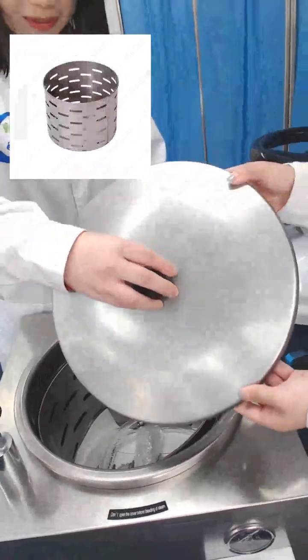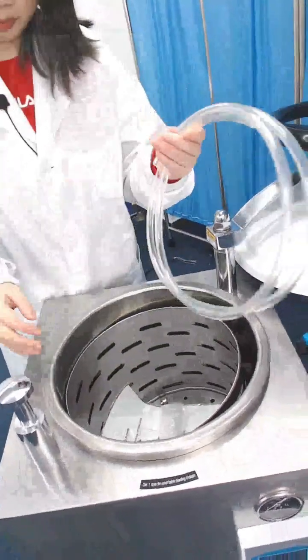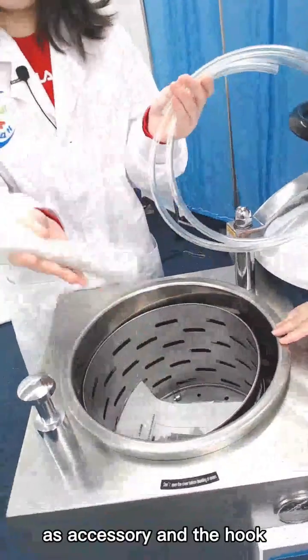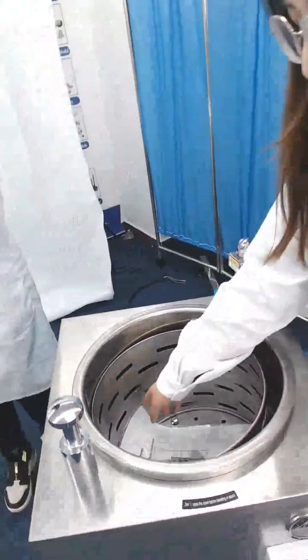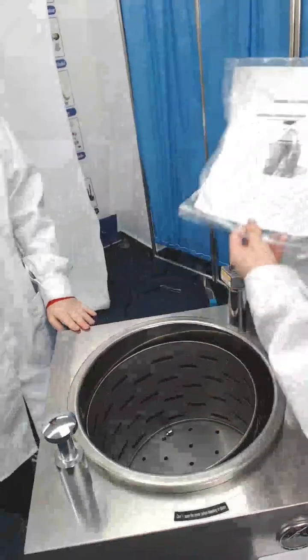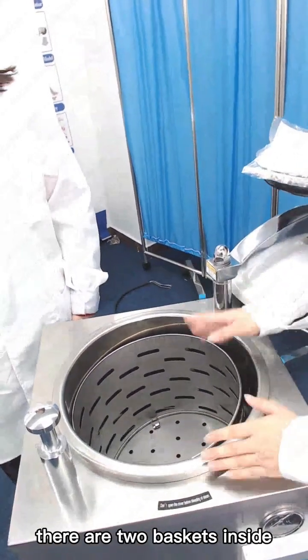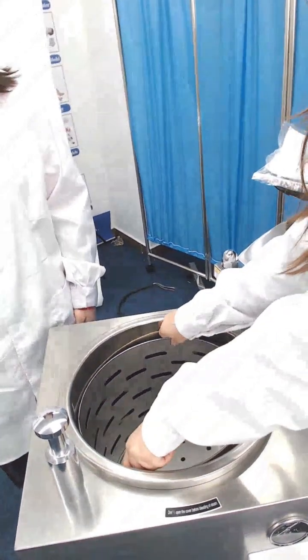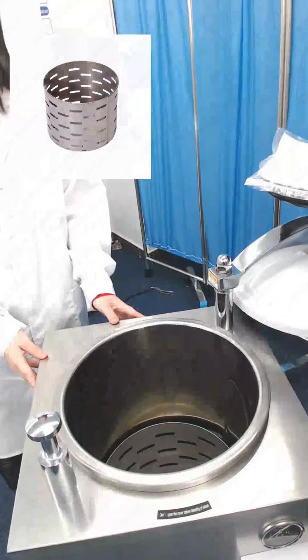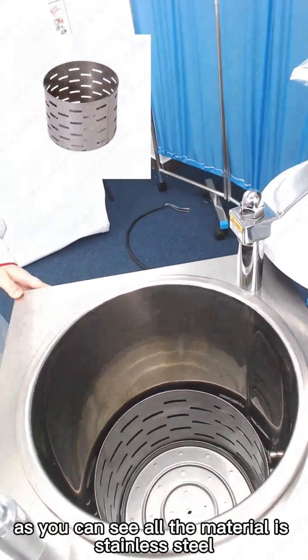You can see there is a lid here. We also have the tube as an accessory and the hook. Here is the user manual. For this 50-liter sterilizer, there are two basket trays inside. As you can see, all the material is stainless steel.